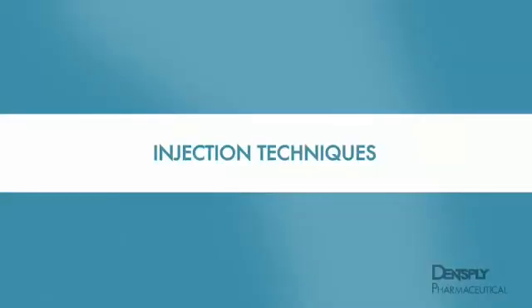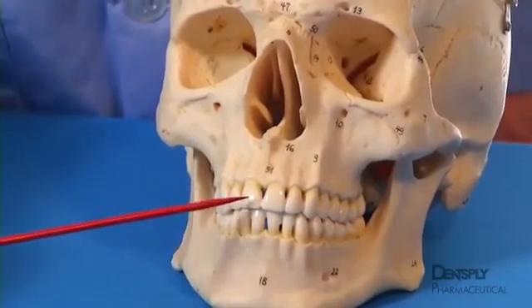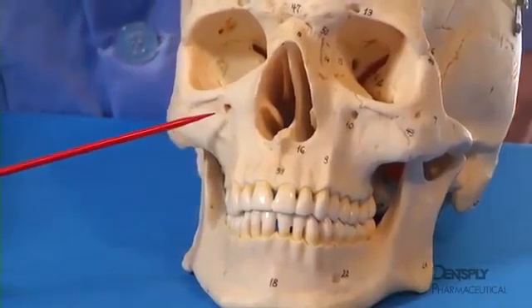Injection techniques. Infraorbital nerve block. The infraorbital nerve block will anesthetize in one injection all peripheral branches of the infraorbital nerve, the anterior superior alveolar nerve, and often, when present, the middle superior alveolar nerve. At times, local anesthesia can be obtained from the central incisor to the mesiobuccal root of the first molar. The target site for the injection is the infraorbital foramen.